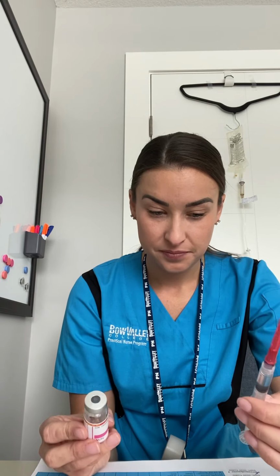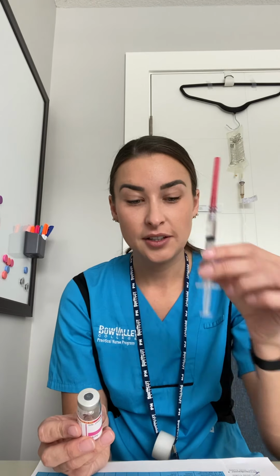Okay. So now that we have the medication drawn up, we're going to do a second medication check. So we have our stock medication. We have our MAR here. We also have the doctor's orders underneath, but we're going to go towards MAR. So we have dexamethasone. We're giving 4 milligrams, so 1 milliliter, to Allison Chinook.